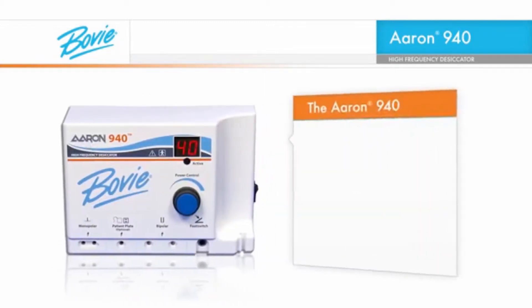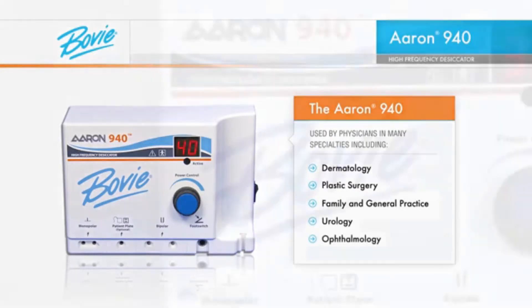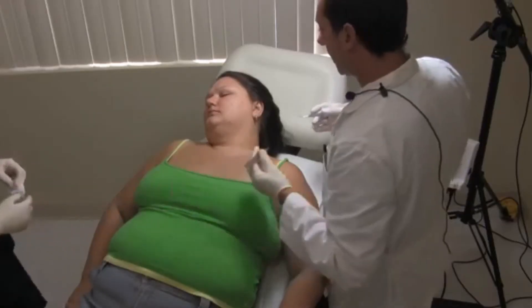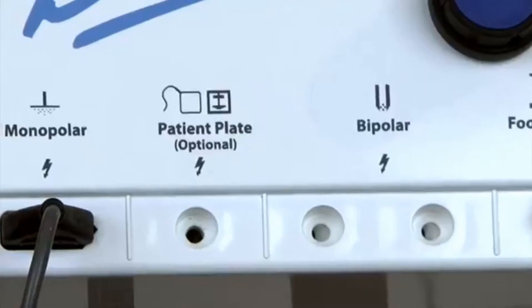The Aaron 940 is used by physicians in many specialties, including dermatology, plastic surgery, family and general practice, urology, and ophthalmology. With the Aaron 940 high-frequency desiccator, office-based electrosurgery has a new standard incorporating 21st century technology.